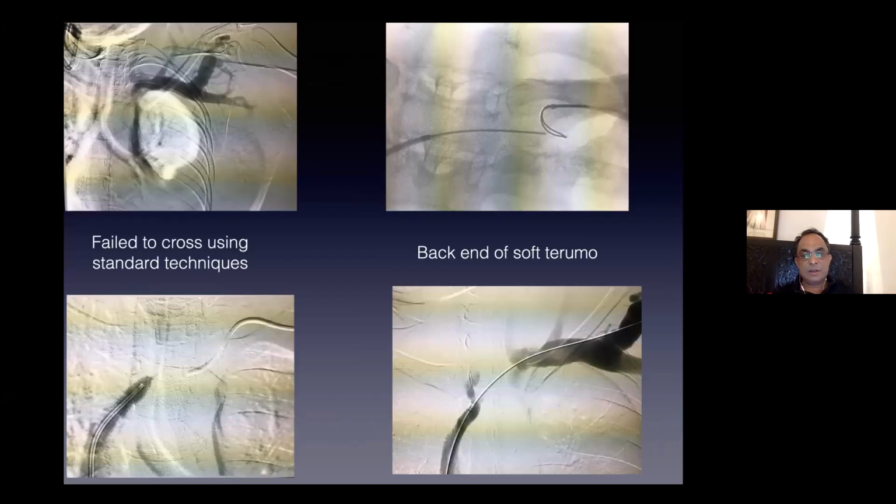Once you've gone through the sharp, sometimes I'll just push the catheter if I'm really brave, because you do get a feeling once you've gone through, and the feeling could be extravascular too, I guess. But with experience, you get this little feeling, and you know that you are in the vessel. If you are confident, you can push the catheter over the sharp part, but it's usually safer to see whether you can snare, because if you can snare from the other end, then by definition you're intravascular. So then we just hold the snare in that place and we push the catheter through.